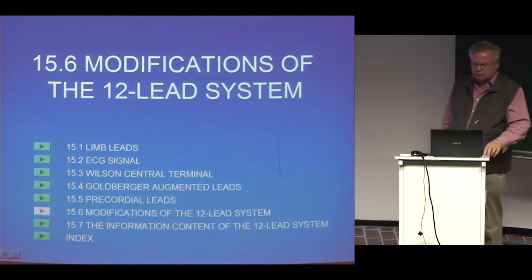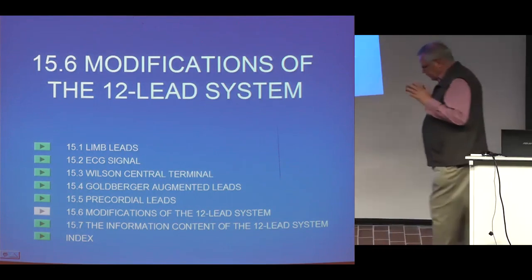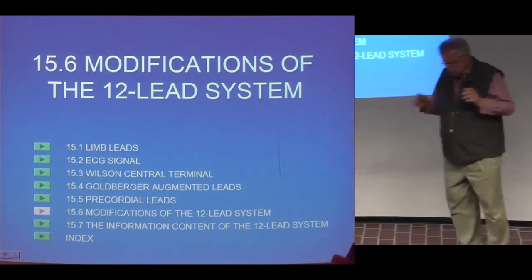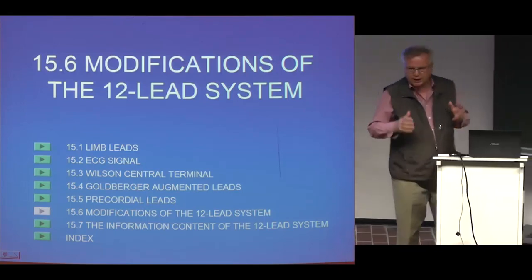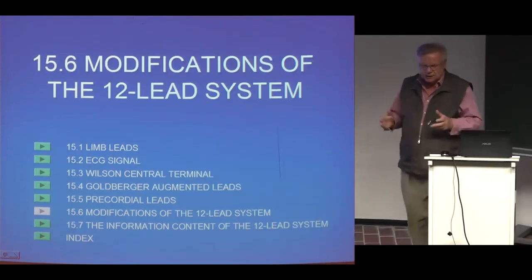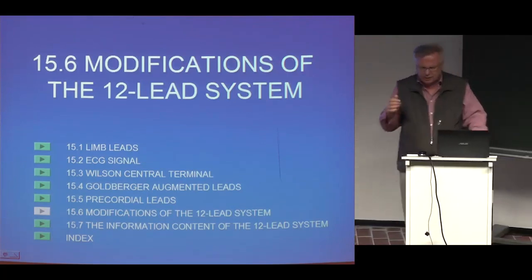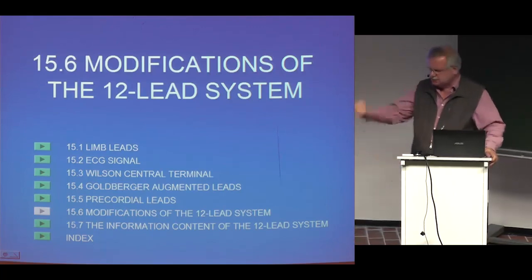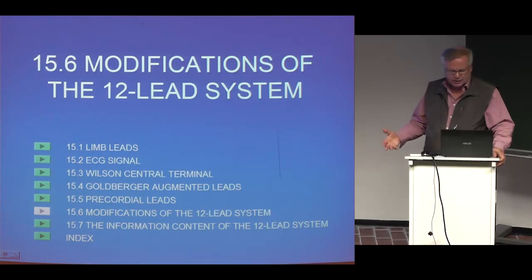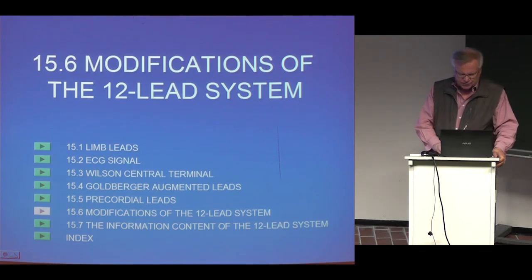There are several modifications of the 12-lead system. Firstly, I would say that the 12-lead system is a consequence of long historical development. And it is the standard recording lead system which is used in hospital. When the patient is taken to the hospital, what is first taken is a 12-lead ECG. That's it. But of course, there are certain modifications of that.